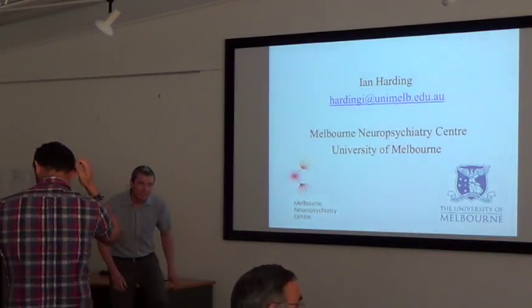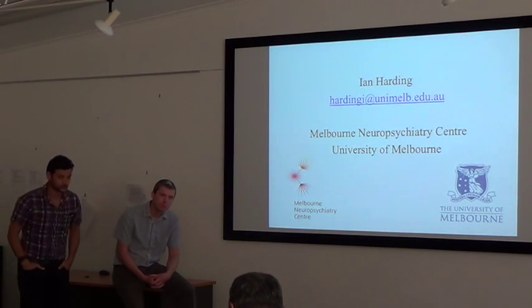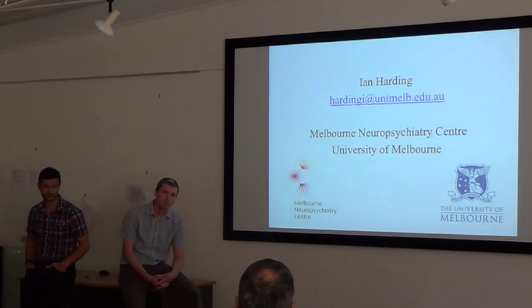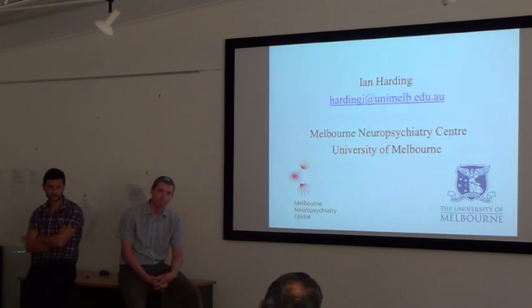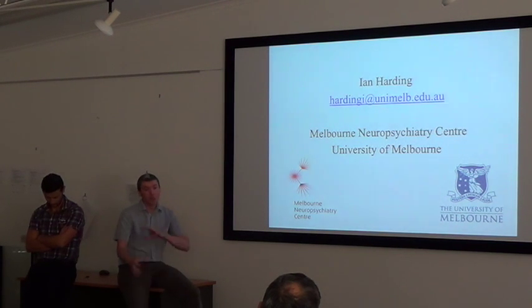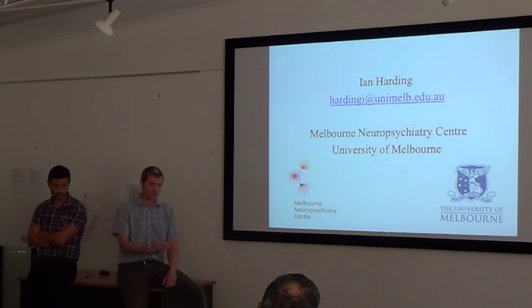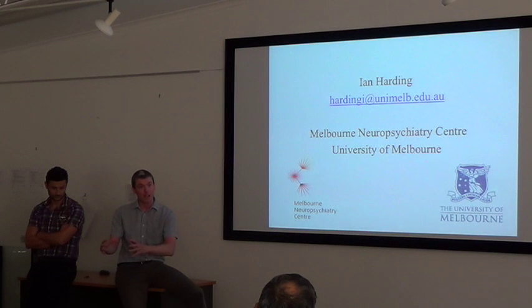Yes. So, when you look at fMRI, do you also, in the scanner, take the MRI at the same time, and then you somehow put the signal onto the structural image? Is that right? So we actually do it at separate times. We get what we call a T1 weighted image first, which is our structural image, and then we would do the functional afterwards.